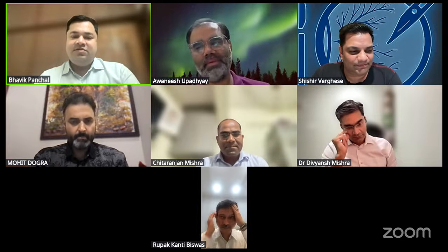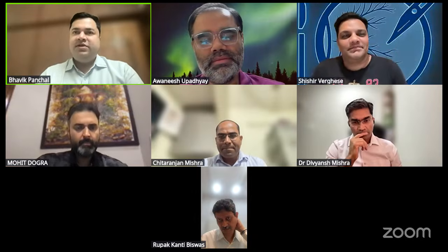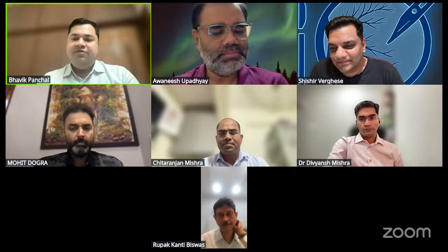No, but I think apart from that, jokes apart, fantastic technique from both of them, Avnish and Shishir. So this is now open to all our panelists. We'll start with Dr. Rupak first. What are your thoughts per se on retinal transplant or using AMG for such chronic holes? And how do you deal with them?